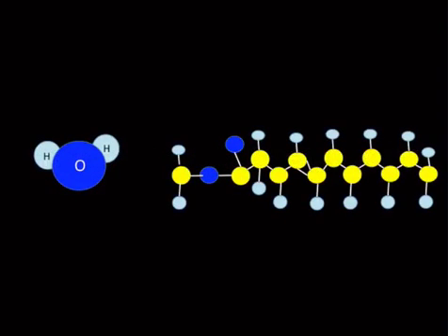Now, water and fat are different. They spin differently. They have different T1 relaxation times, and it has to do with complex organic chemistry stuff, electronegative oxygen pulling protective electron clouds away from the hydrogen nuclei, all that stuff. You don't need to know that.